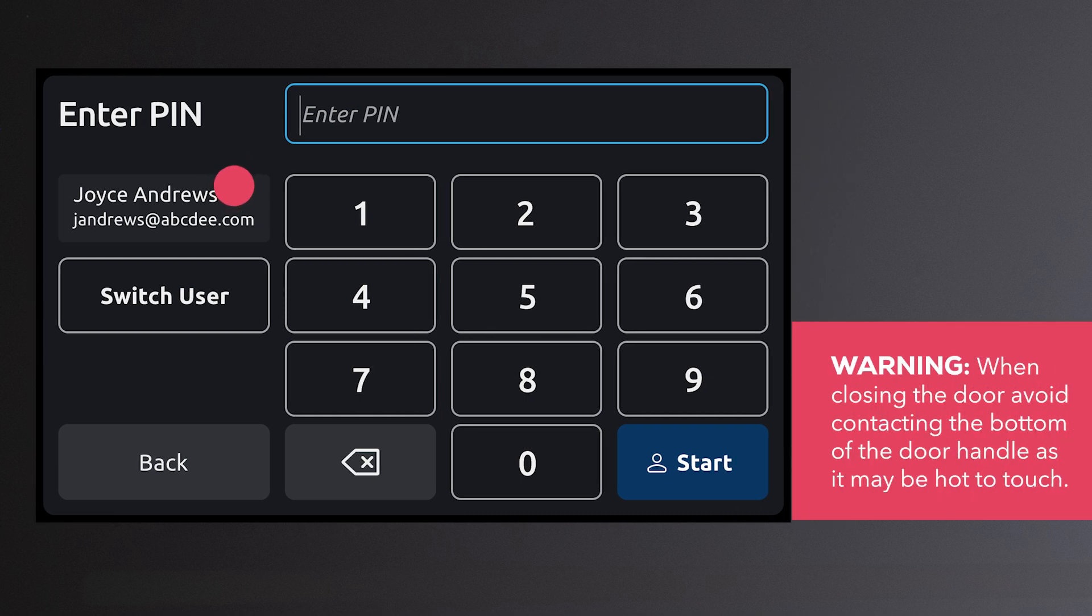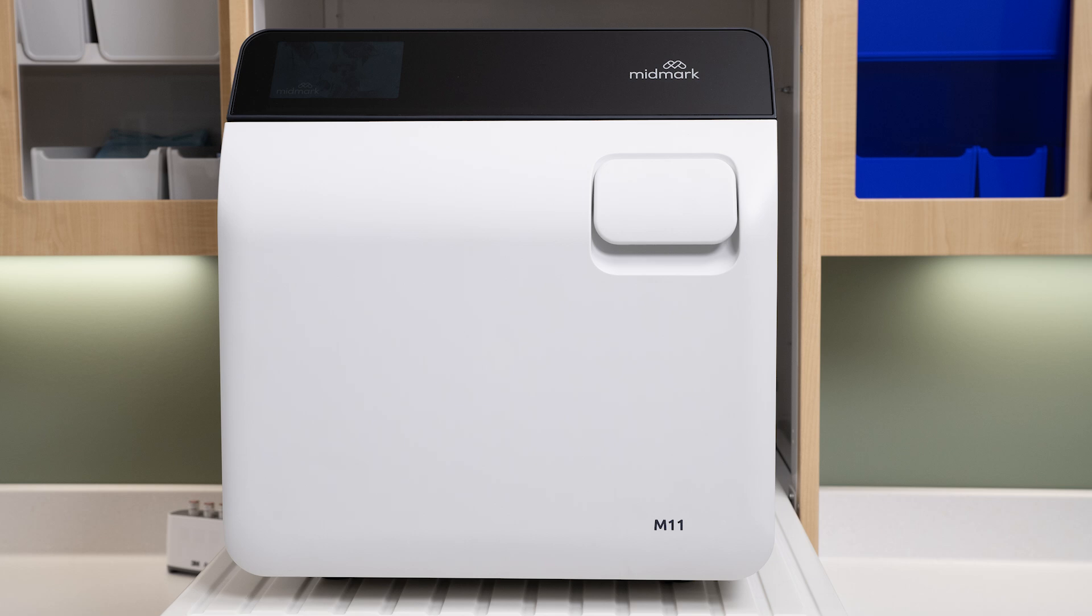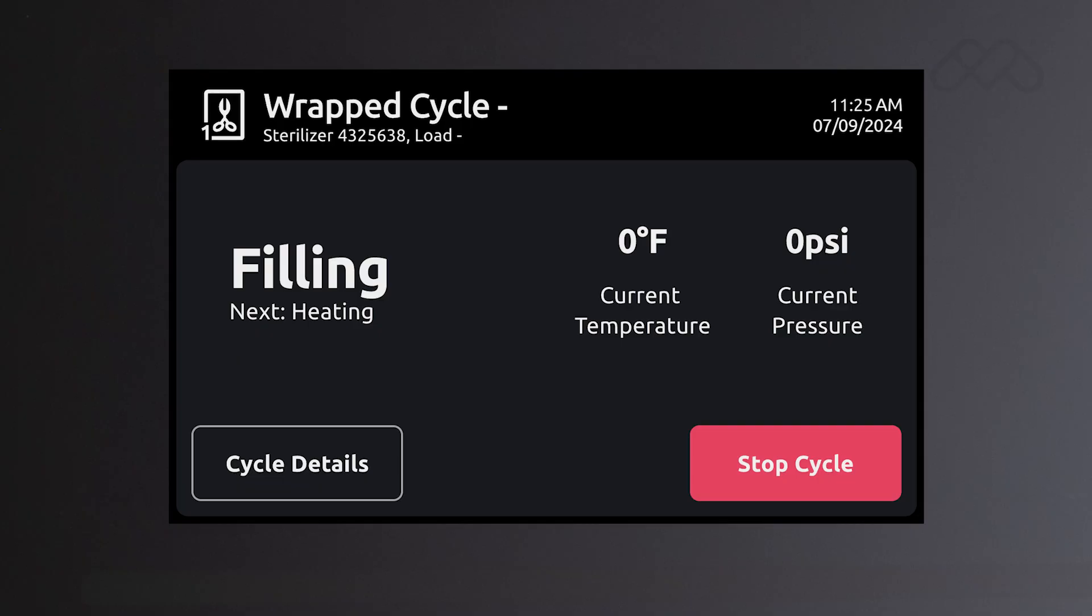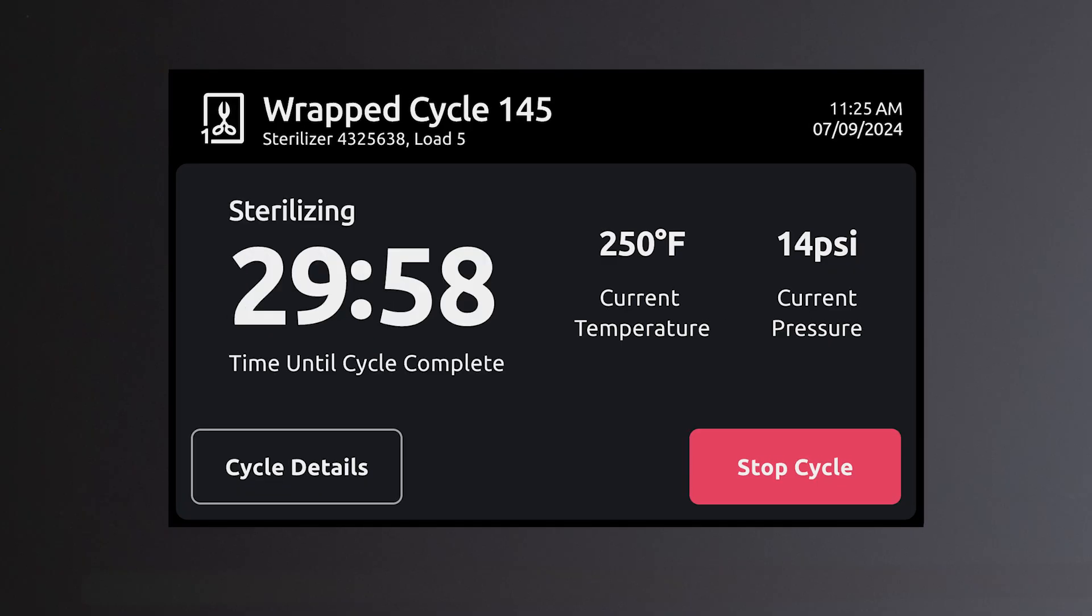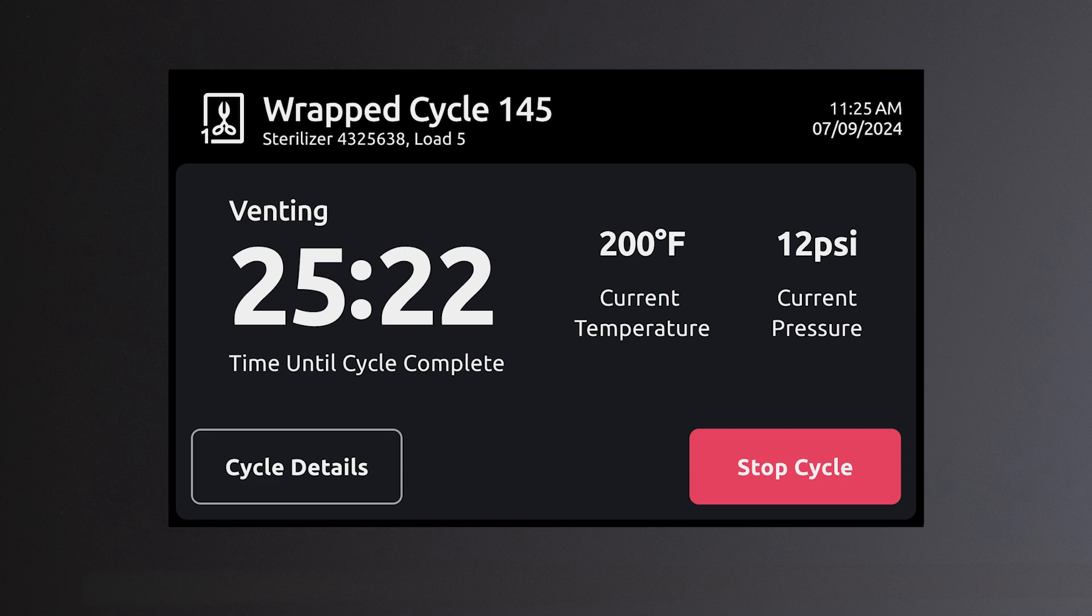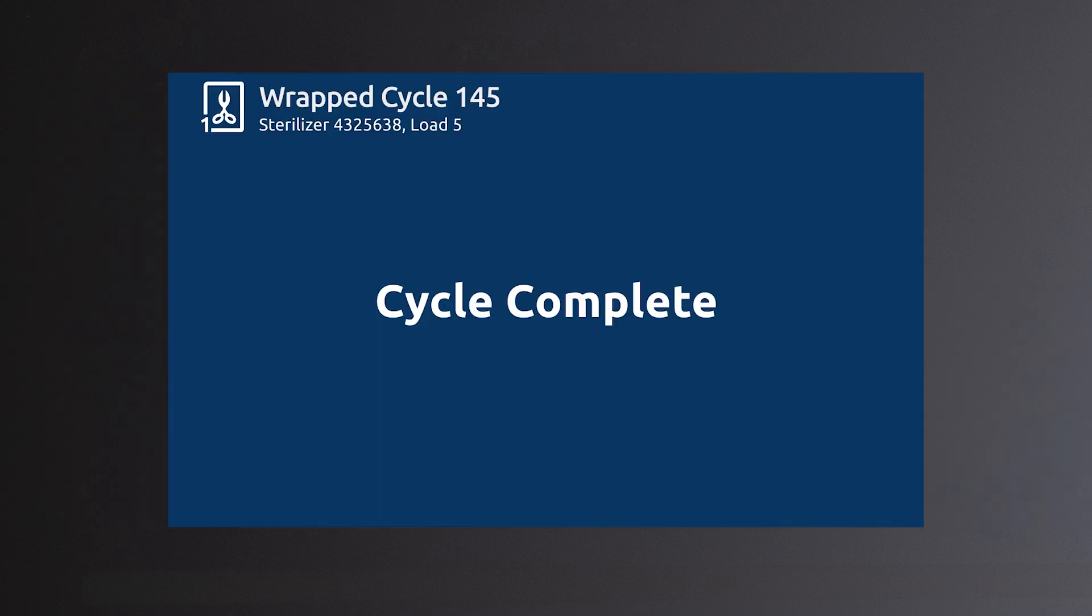Select the user, enter the pin, and press start again. The sterilizer will progress through the following stages: filling, heating, sterilizing, venting, door opening, drying, cycle complete, and cycle summary.